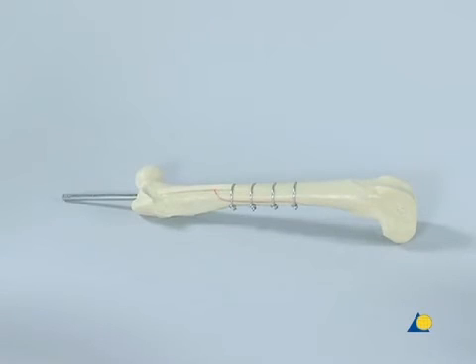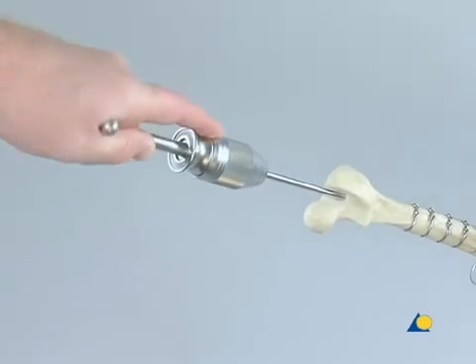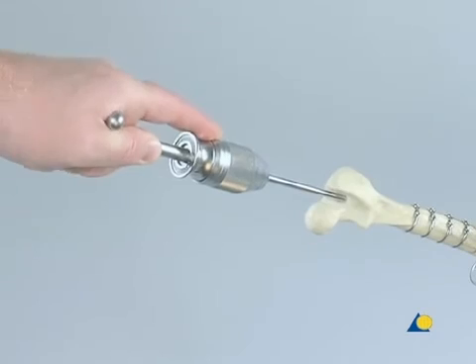Although in a clinical situation the pin is trimmed, here the pin is left intact and is removed at the end of the exercise. The pin can also be inserted by hand with the universal chuck with T-handle.